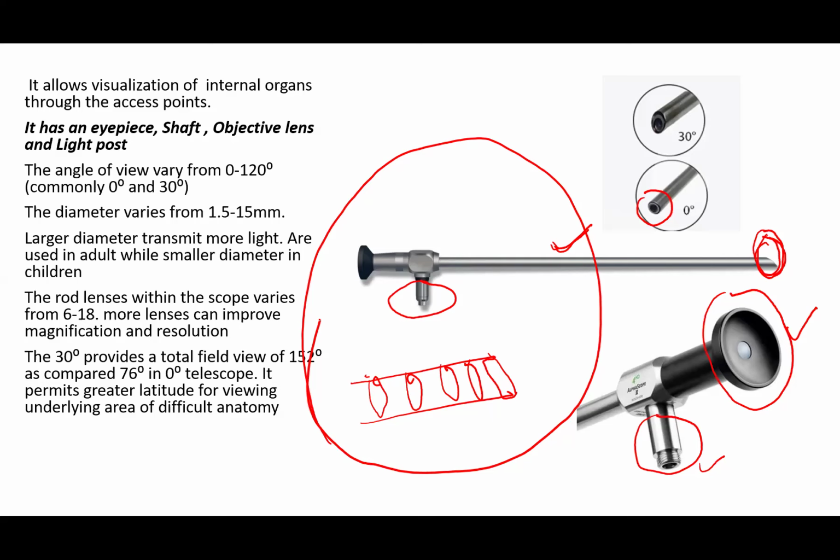They have no contact with or experience of using the, what do you call it, the 0-degree. But the 0-degree telescope will just give you an overview, just like you are viewing from the top, a 90-degree flat view without any angulation. If you are looking for any angulation, you manipulate to look for it.